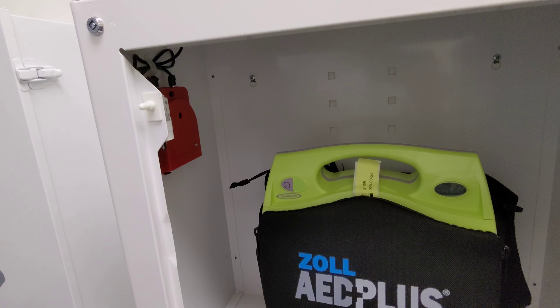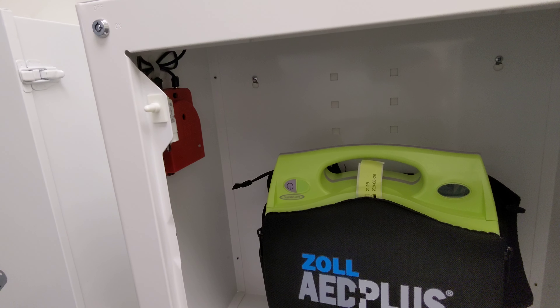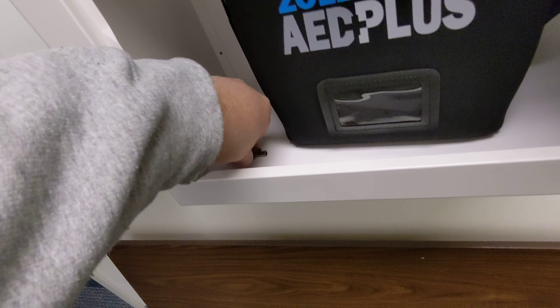Hi everybody. So we've got this Syntas AED thing hanging on the wall here at work and it's been beeping for the last two days. I have a feeling it has something to do with this alarm on the door. I think the battery is going dead.